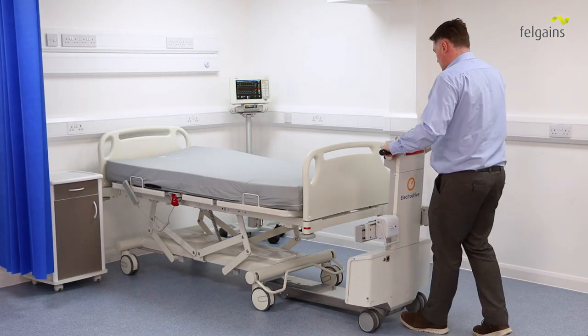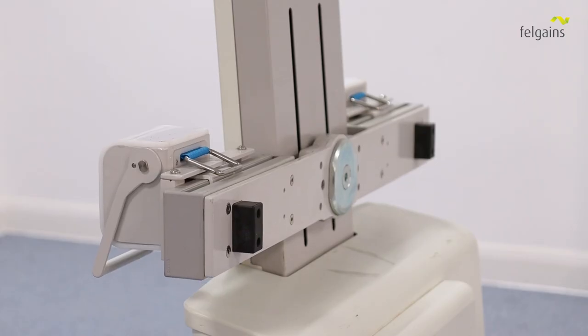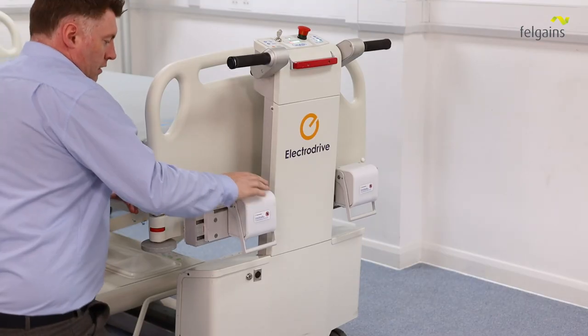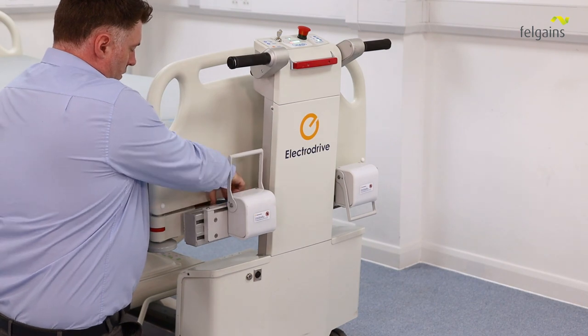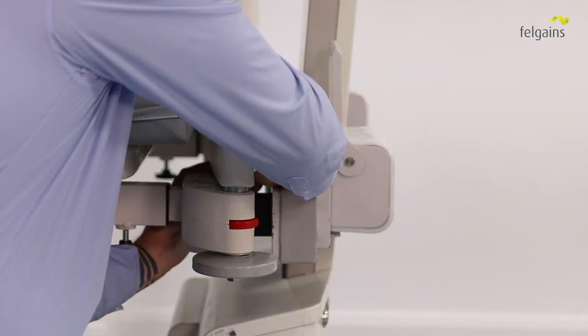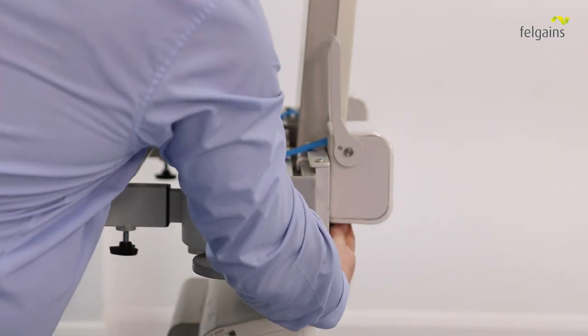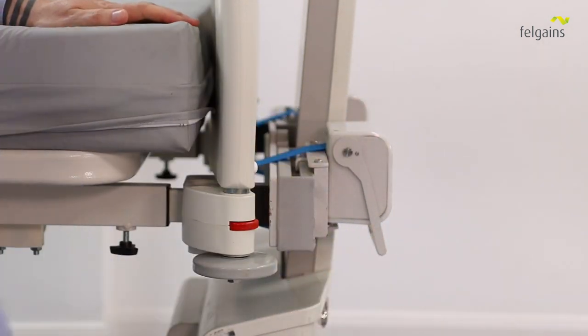Wheel the bed mover up to the bed or stretcher, then adjust the hitch height to match the frame of the bed. Next, undo the latch and pass the strap around the bed frame, placing the hook on the underside of the hitch. Then pull the latch back down and the strap will tighten.